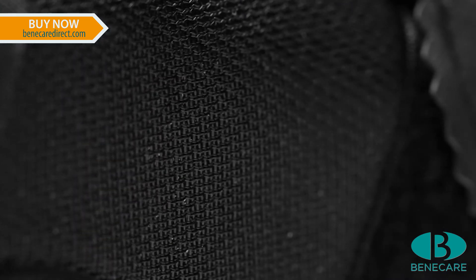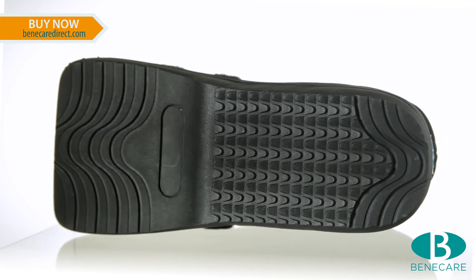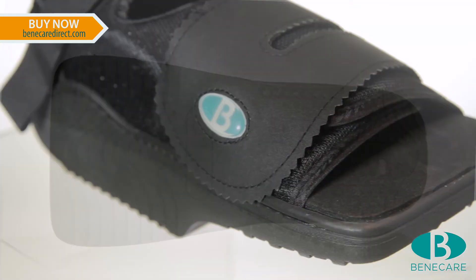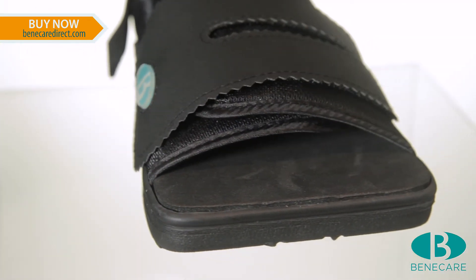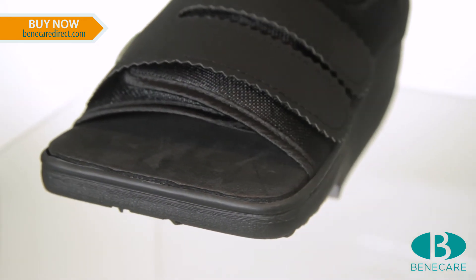The shoe is made from a soft, breathable material. The advanced tread system on the sole increases traction when mobilising. It has a square toe with a wide base for added protection, for example post-operative and when K-wires are in situ.